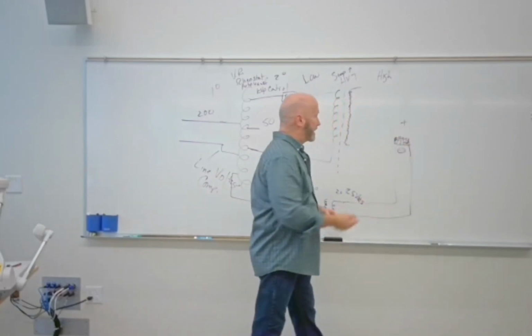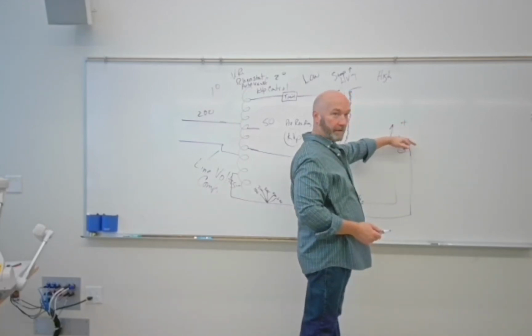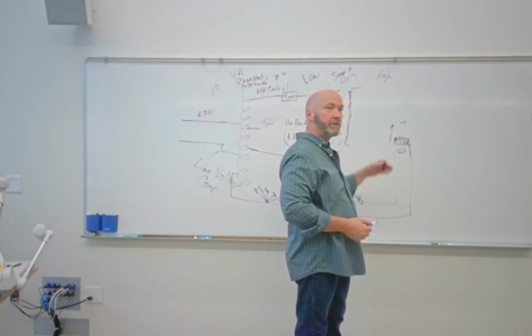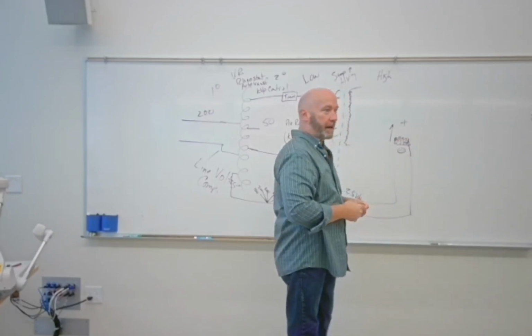Now, once you hit it with a kVp and those electrons jump across the tube, where are those electrons? Are they still hanging around the filament? The answer is no, they're not. They've evacuated. So can you put more electrons then at the filament level? The answer is yeah.